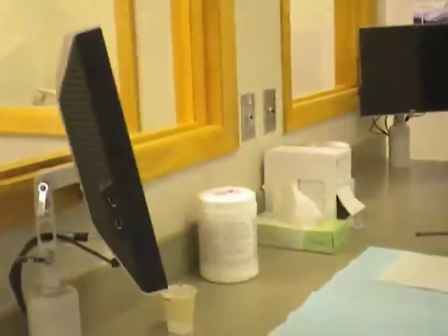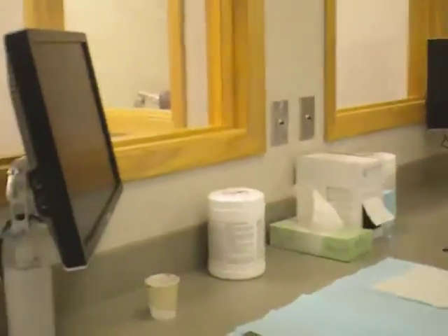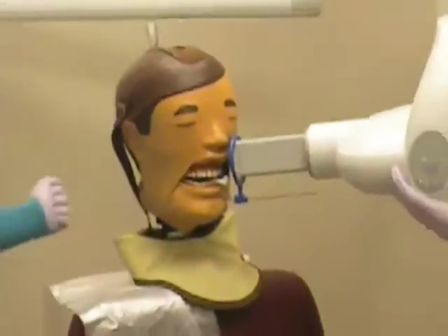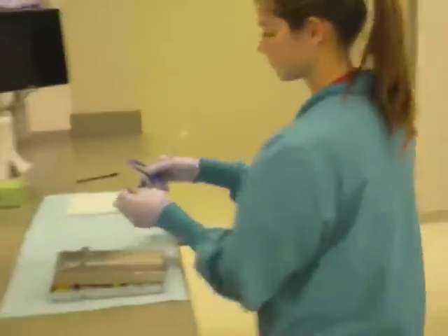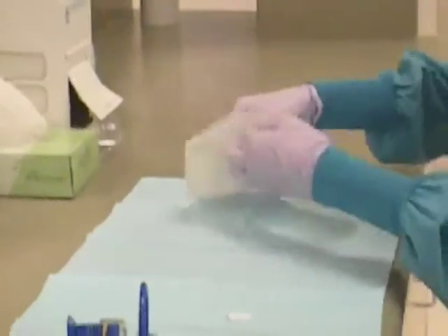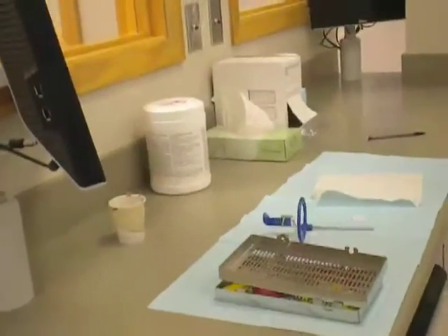Exit the room and stand behind the lead glass window. Press the exposure button to complete the circuit and hold until the beep stops. Move the X-ray tube to the side and remove the XCP instruments from the patient's mouth. Take the phosphor plate out of the bite block and wipe it down with the cleaner. Drop the dry plate into the cup. Remember not to touch the cup with contaminated gloves. Remove gloves and take the cup to the dark room while the patient waits in the X-ray chair.